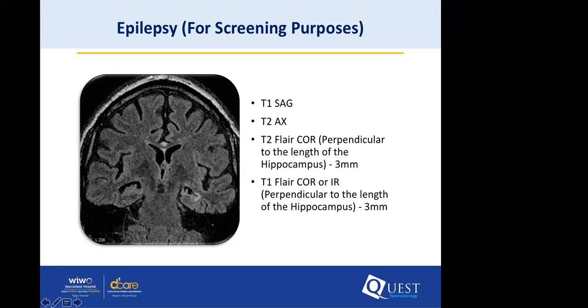There is atrophy and there is edema, hyperintense signal. Edema is hyperintense on T2 rather than T1. That's why I prefer T2 sequences. So you could get an atrophy of the hippocampus or hyperintense signal as well. So the hippocampus is where you have to look, and T2 FLAIR coronals, you can do axials as well. Coronals show it beautifully. So T2 FLAIR is your key sequence for epilepsy, because you would want to image the hippocampus.